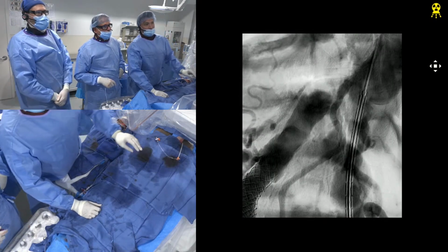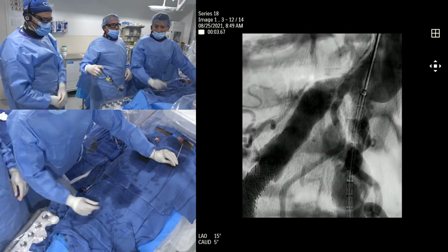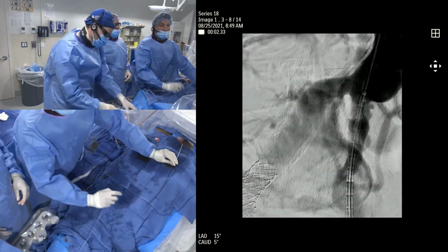I'm going to leave it there. Yeah, it's perfect. What do you think, Xavier? That's pretty good. I think it's perfect. Go ahead, buddy. What's nominal? Puff again. Okay. 12 is nominal. I got it. You can go up.